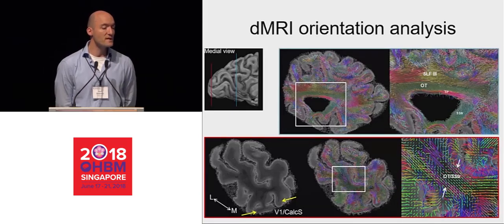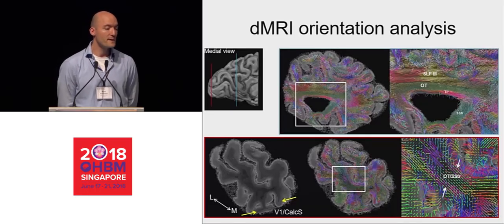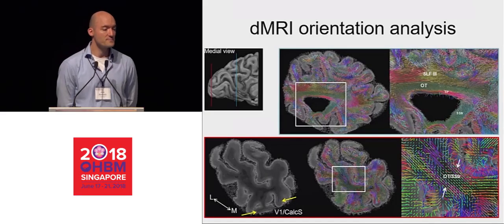You can see that not only can we find the green optical tract there, moving from the lateral geniculus all the way to the calcarine sulcus, but also the fibers that cross through that, such as the 2 smaller U-like fibers that I've indicated with the white arrows there.